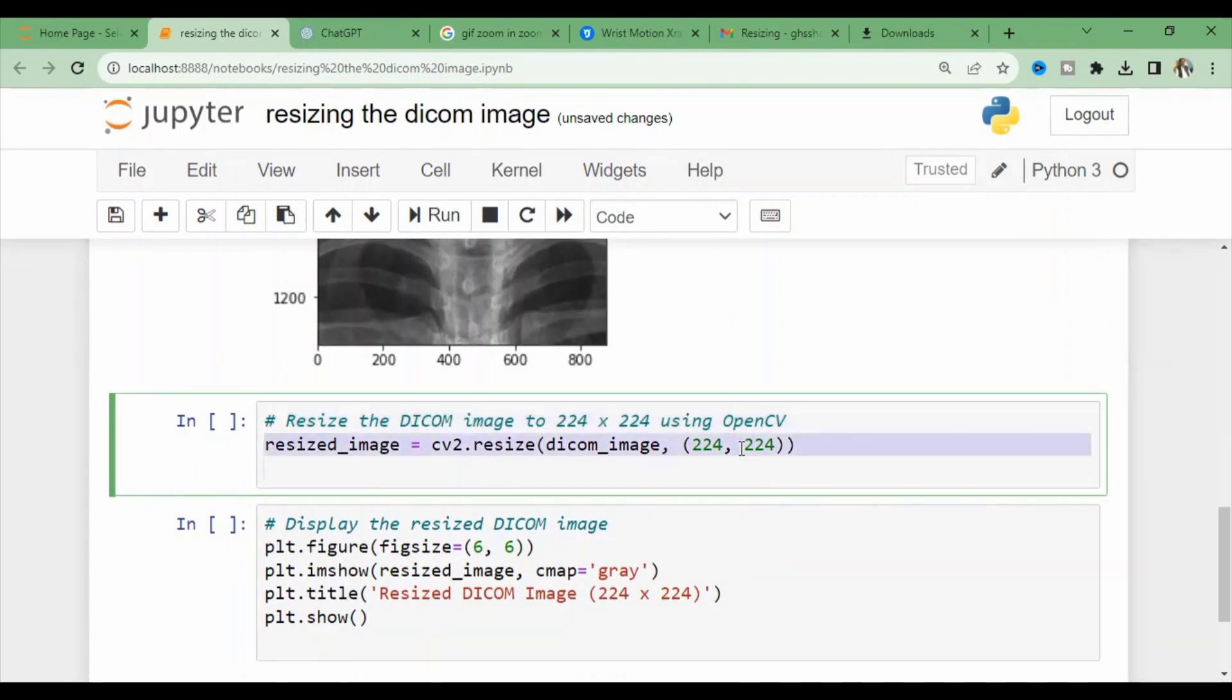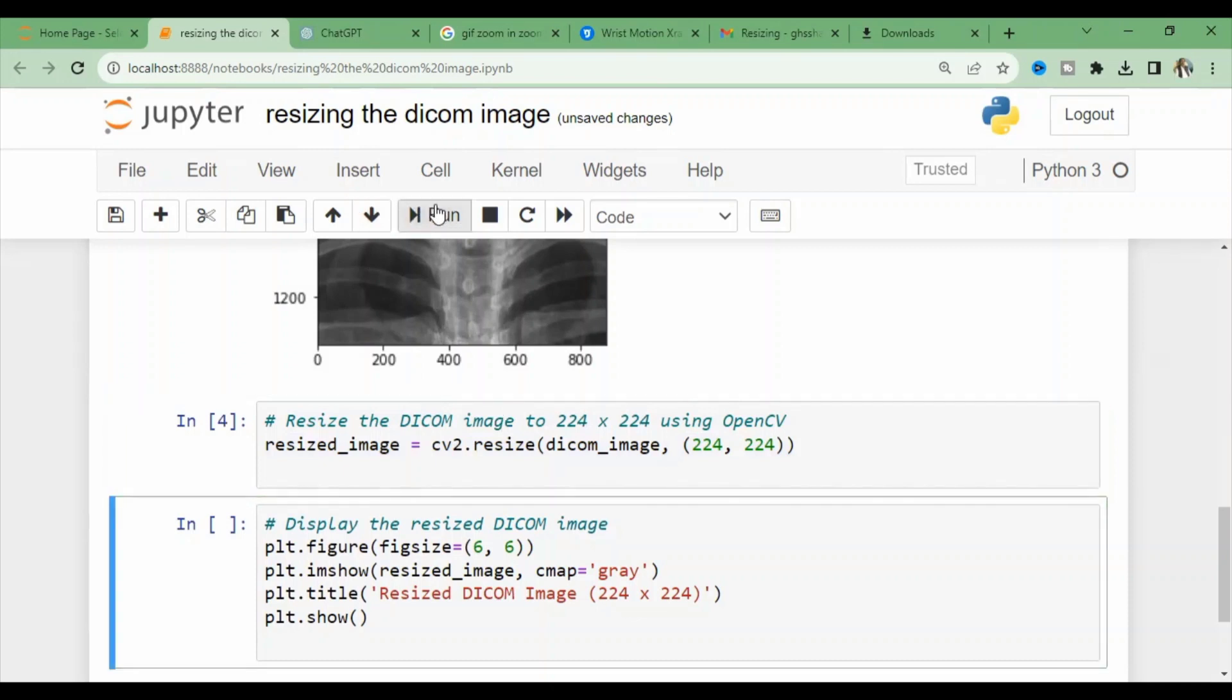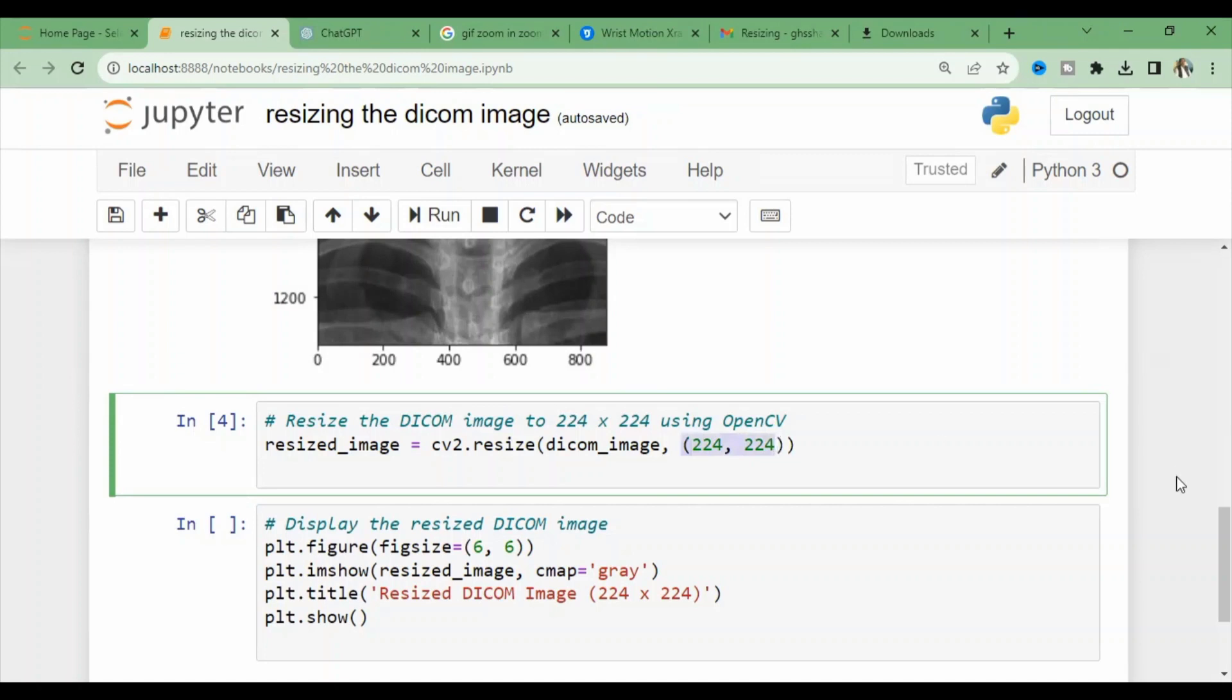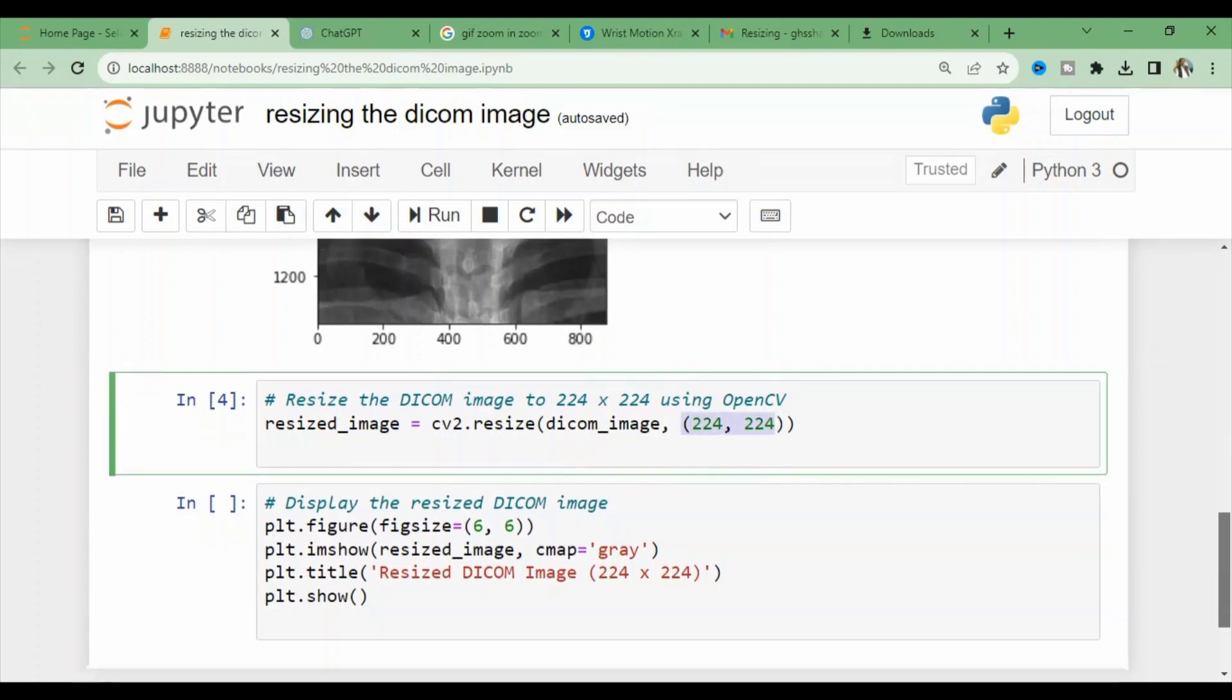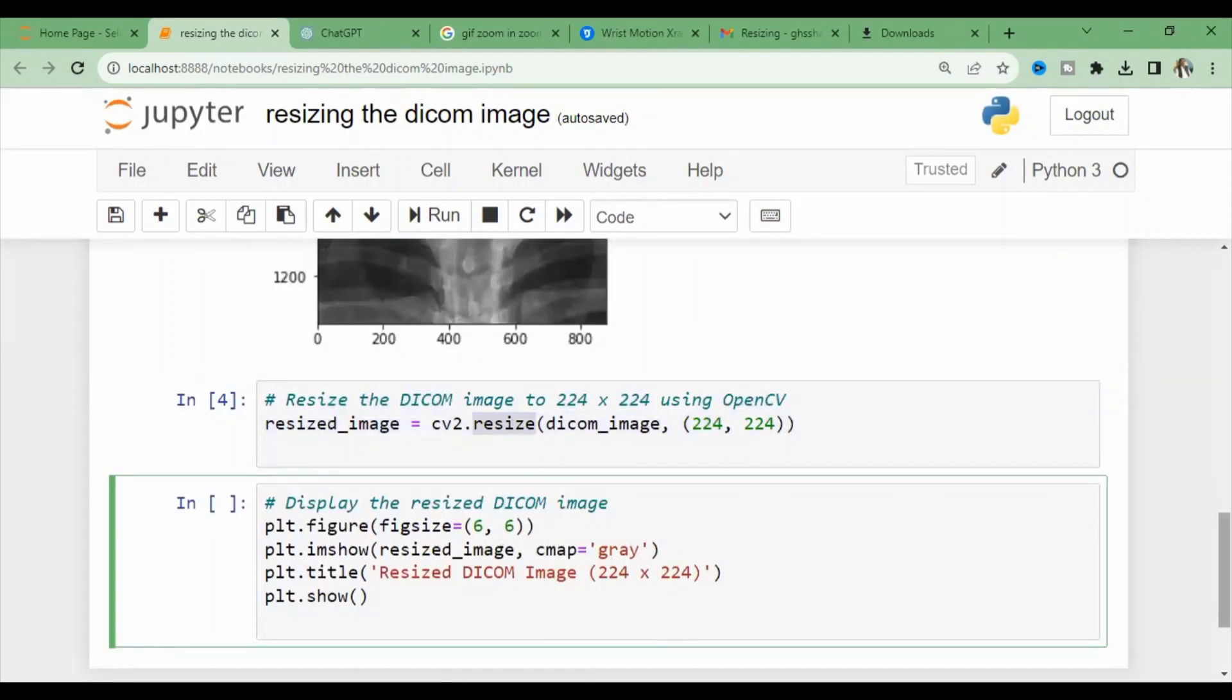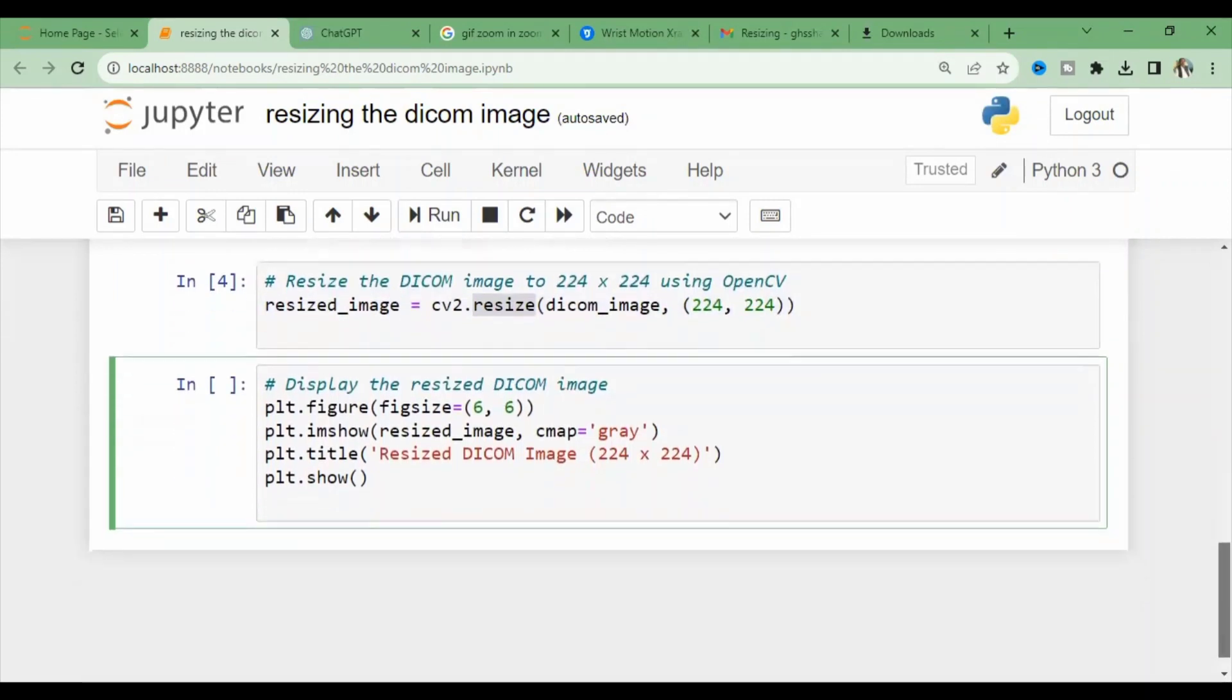Here we are using OpenCV and converting this image into a 224 by 224 size. You can see the cv2.resize function applied to the DICOM image, and here are its coordinates of the rows and columns. Now we can compile and display the resized image.